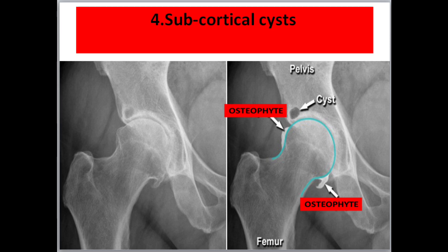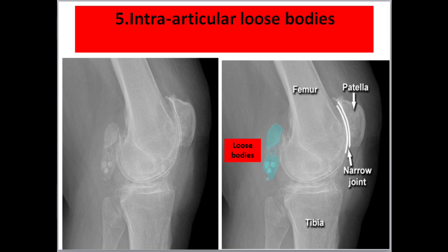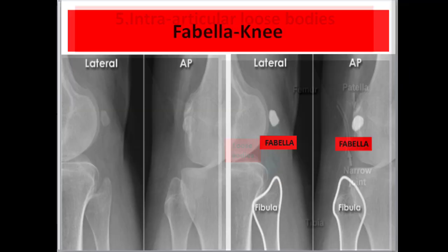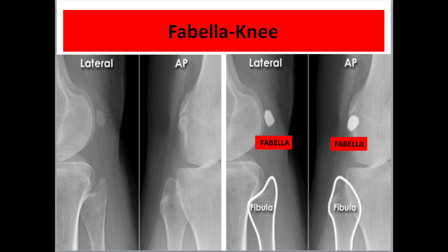Five: intraarticular loose bodies. In some patients, calcified loose bodies may be seen within an osteoarthritic joint. These are fragments of bone or cartilage which have detached from the joint surfaces and remain in the joint capsule. This lateral view of the knee also shows severe osteoarthritis of the patellofemoral joint, which is very narrow. Note: do not mistake the fabella for a loose body — this is an example of a normal fabella.